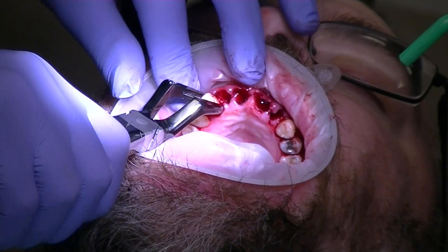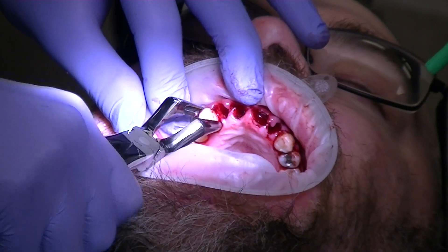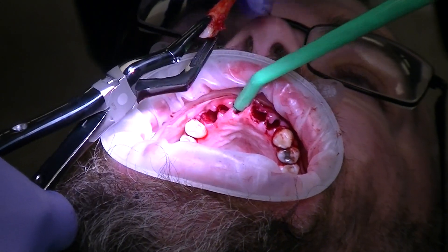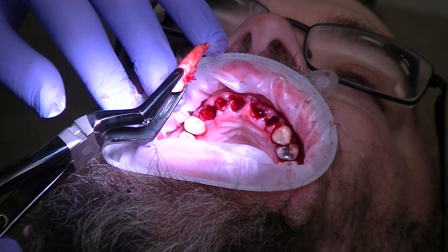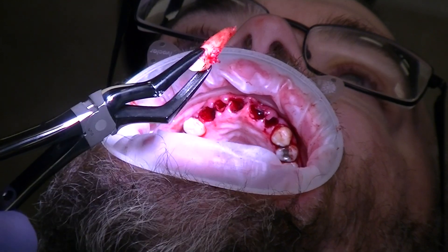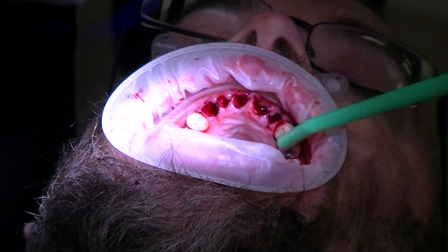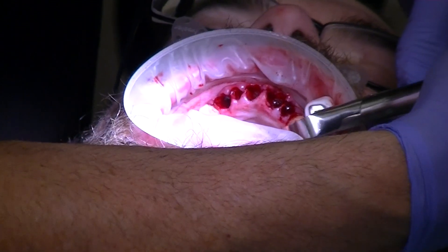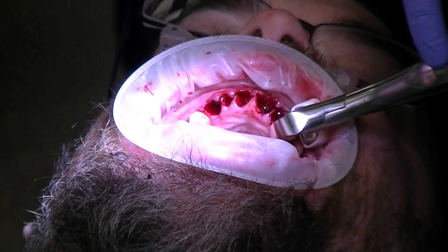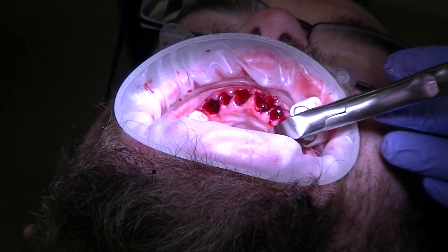Open just a little bit Kevin. You can push up a little bit and then rotate — you're going to find it comes out at the proper orientation. Look at the curvature on that root. Normally you could break that, but utilizing the physics forceps to loosen it first really makes it a better situation. Last tooth for me Kevin, then we'll get one of the docs to do the rest. Follow the long axis — if I have to move over here so I can see it correctly, I'd recommend that in your practice.